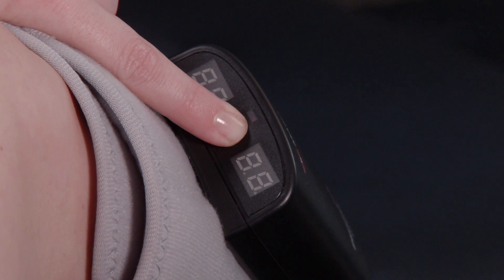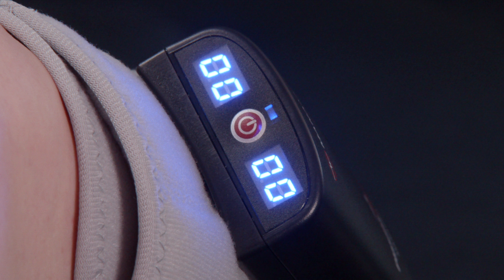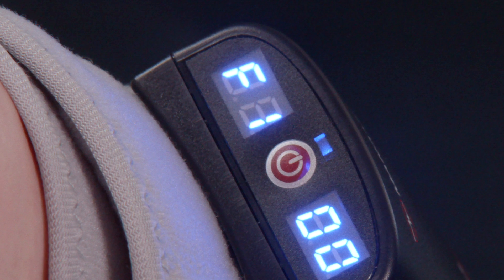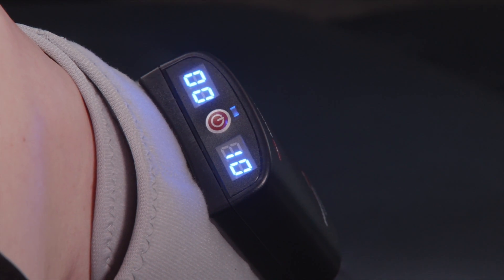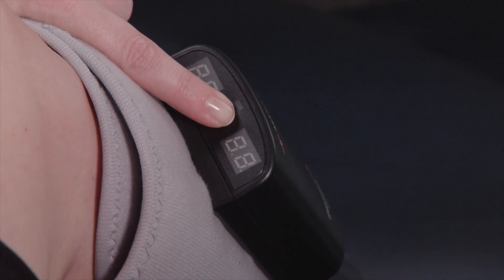Press and hold the power button for 3 seconds until the blue light is illuminated on each unit. An F1 will flash on the left side of the display — this turns the unit on. If the unit needs to be turned off, press and hold the power button for 3 seconds and the unit will turn off.